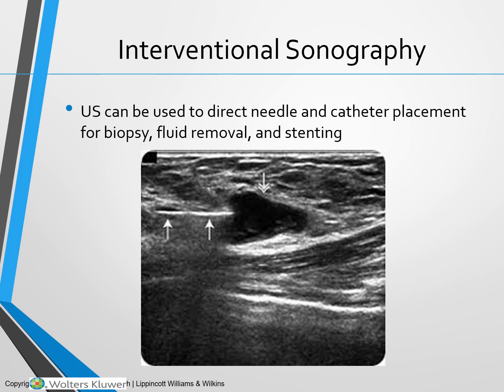Ultrasound can be used to direct needle and catheter placement for biopsies, fluid removals, and stenting. And these are termed types of interventional sonography. And a lot of times these are done right in the ultrasound suite with an interventional radiologist.